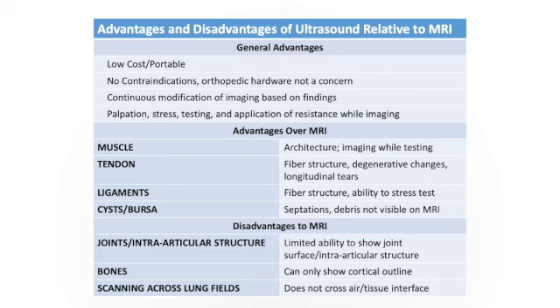As you guys can see, this is a difficult imaging modality to use. There's a lot of operator error here. There's a lot of skill that has to be involved if you're going to do it accurately and to the best of your abilities. So definitely make sure you understand the advantages and disadvantages of ultrasound.